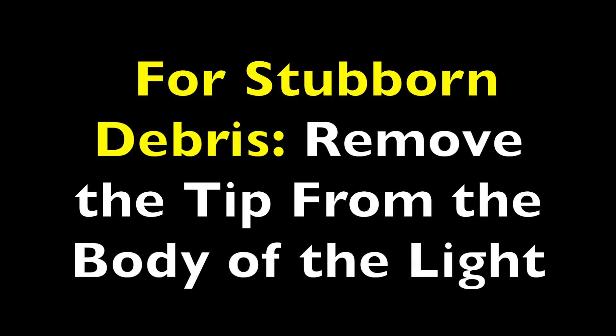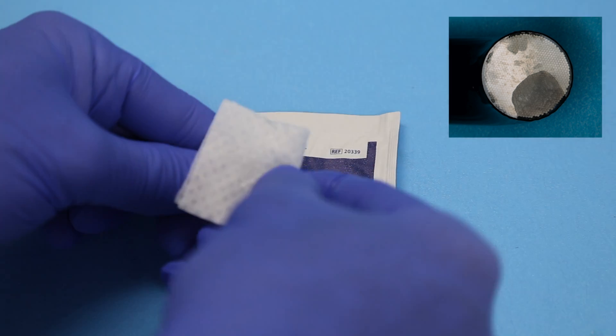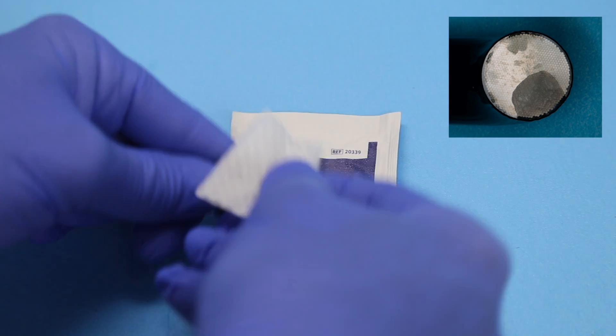For stubborn debris, remove the tip from the body of the light so that you can apply some pressure using an alcohol wipe and your fingernail. Rub vigorously and any debris will come off. Do not use a sharp metal instrument or anything that might scratch the surface of the light guide.